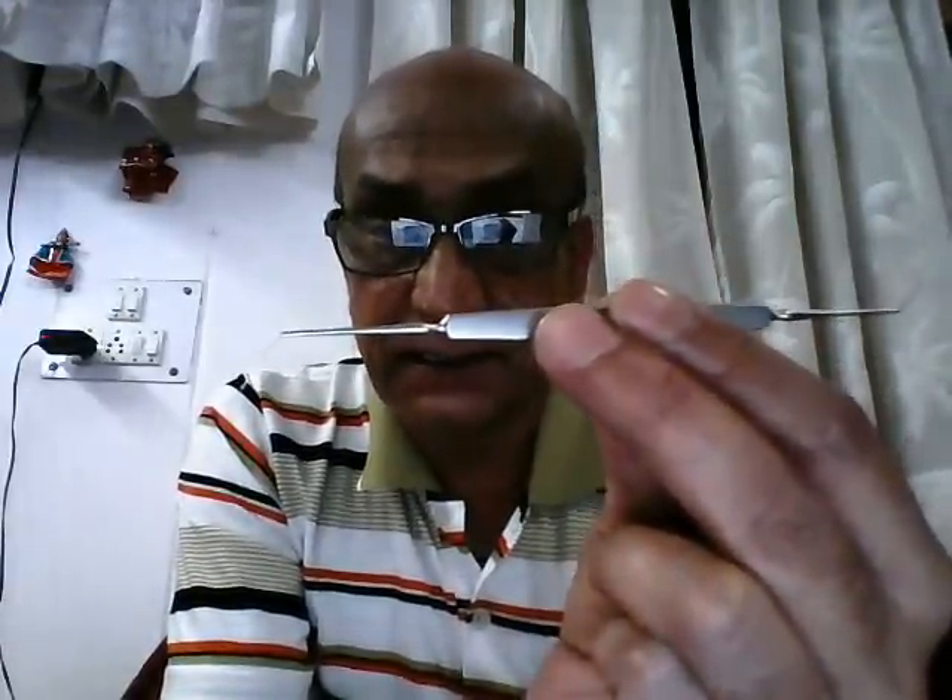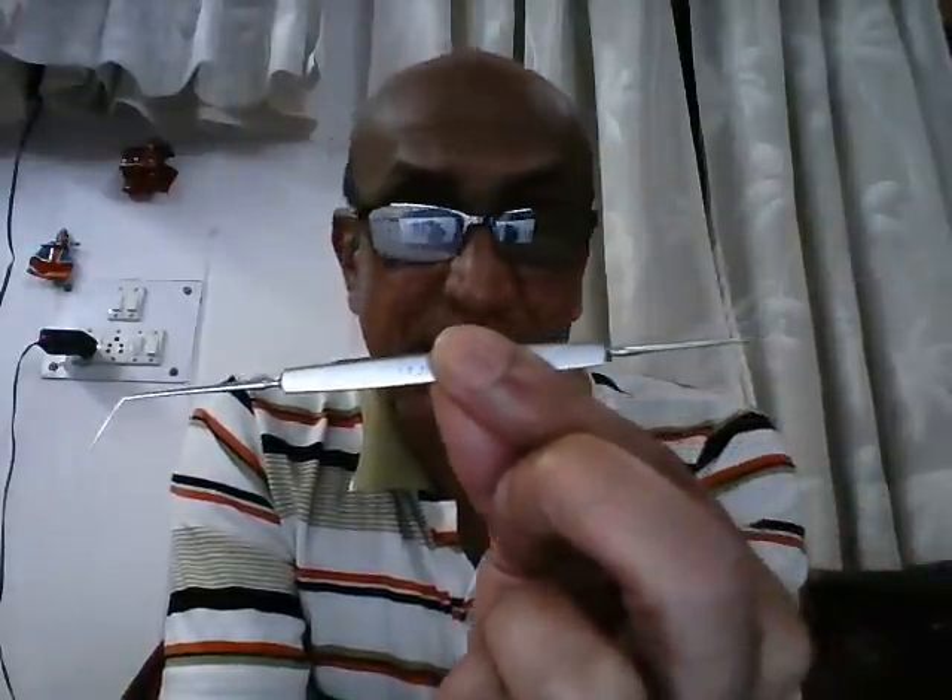This instrument is the Dust tool iris and pupil repositor. The middle portion is the stem held between the fingers, and the two ends have different functions. The first end is flat, blunt, and rounded — this is the iris repositor. Its purpose is to move, position, or reposition the iris, especially when it prolapses during any intraocular or anterior chamber procedure.